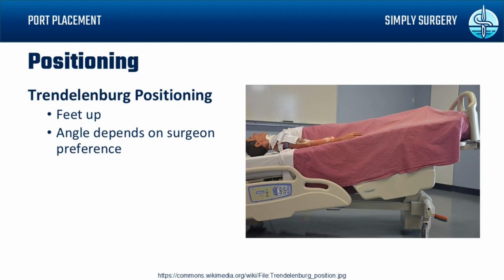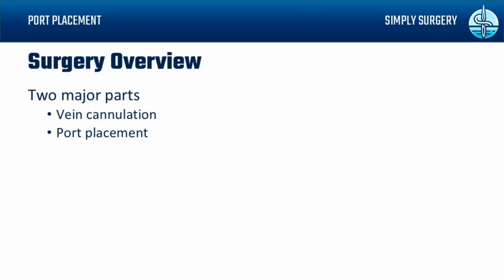So now let's actually step into the procedural elements of the port placement. First of all, the positioning of the patient, you generally want to put them in the Trendelenburg position. Okay, so we've got the positioning down. What's the first step to the surgery?